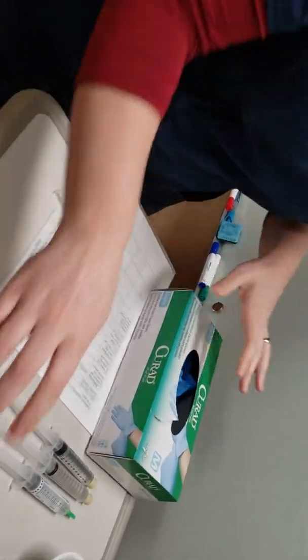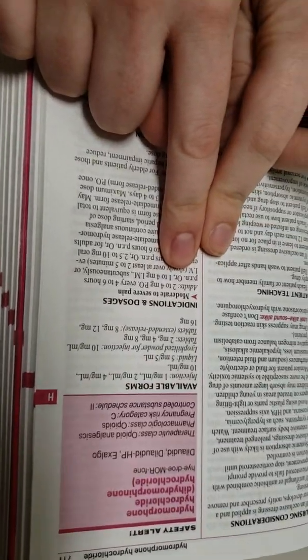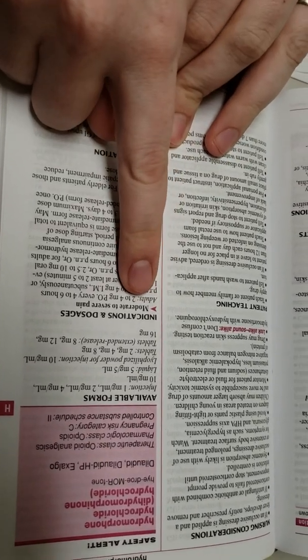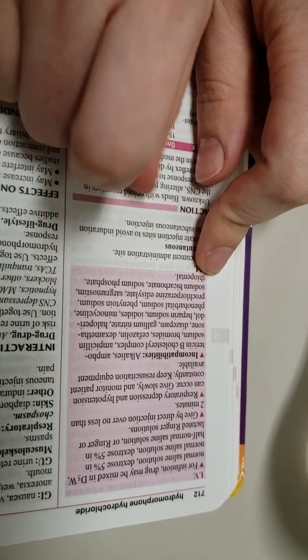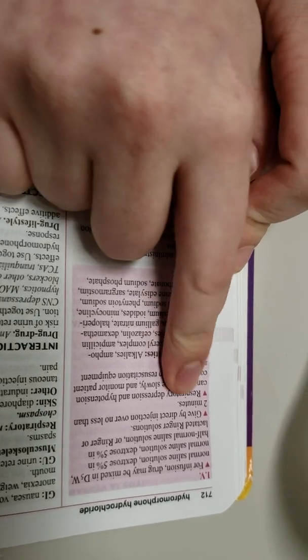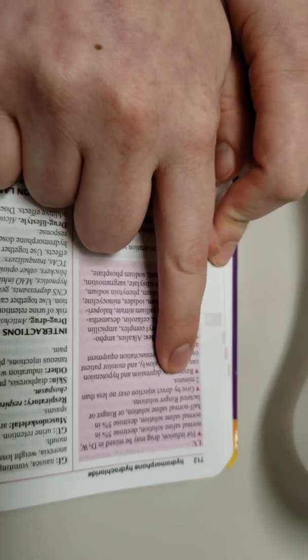Okay. I've also checked my drug book, and looking at the drug book, I know that it follows the appropriate dose, and it is appropriate for my patient for moderate to severe pain. She has rated her pain as an 8 out of 10. I've also looked at the incompatibilities. My patient does not have any primary drugs or fluids running, so I don't have to worry about that. It says to give by direct injection over no less than 2 minutes, so I will give my drug over 2 minutes at least.